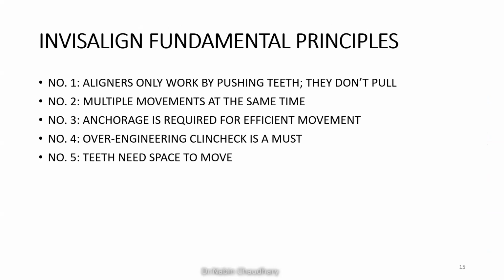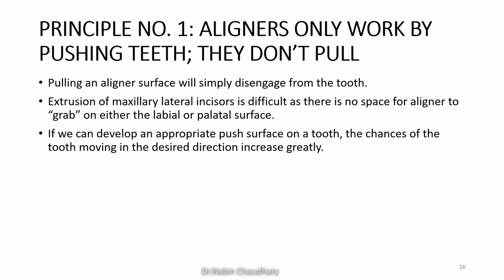So now let's go to the basic fundamental principles of the Invisalign, and it includes the 5 basic principles, and we'll be discussing each one by one. So the first one is the aligners only work by pushing the teeth, and that is they don't pull. So while pulling the tooth using the Invisalign, this will disengage from the tooth.